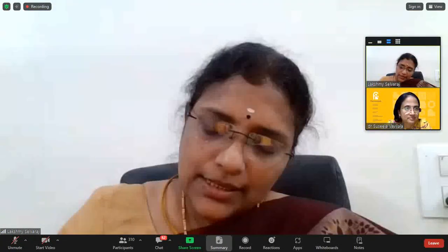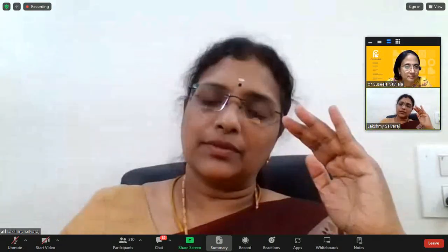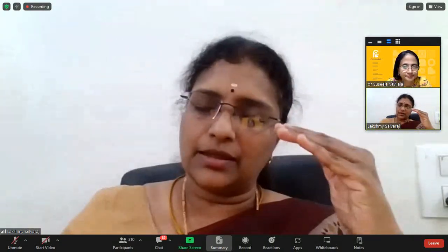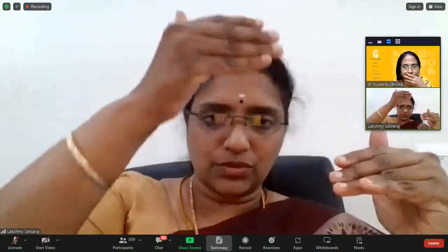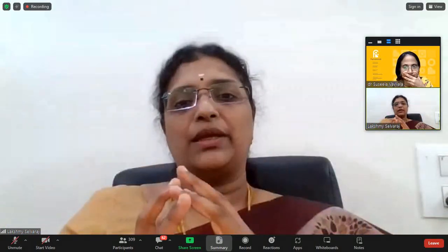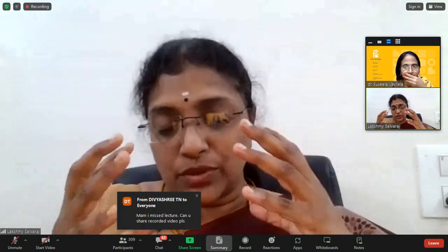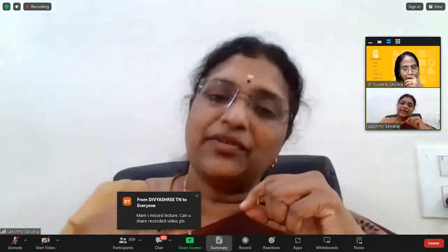Actually, to look at the conus, there is nothing like a low, mid, and high range. If the machine can resolve and show you the lumbosacral curvature, and your beam passes exactly through the midsection, it will show you the conus. The conus does not need a very high range. You only need a higher frequency.